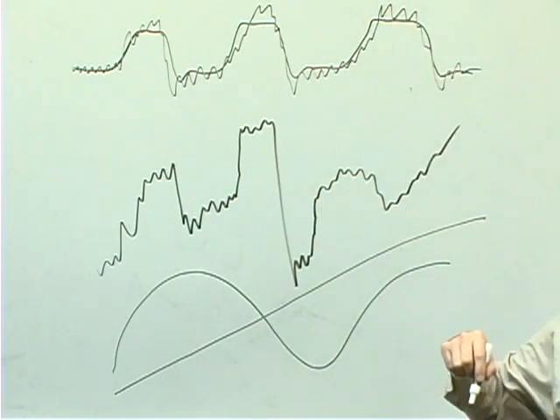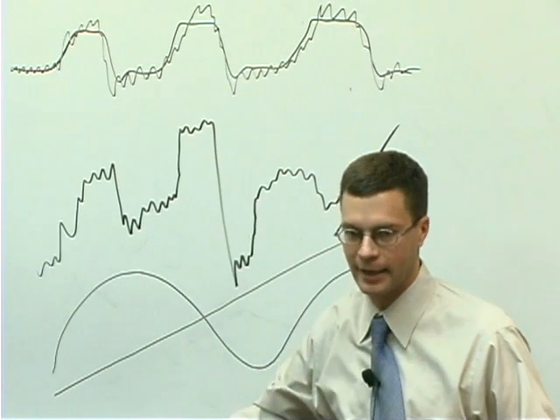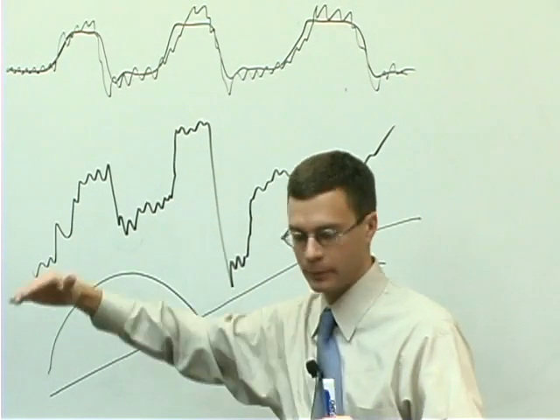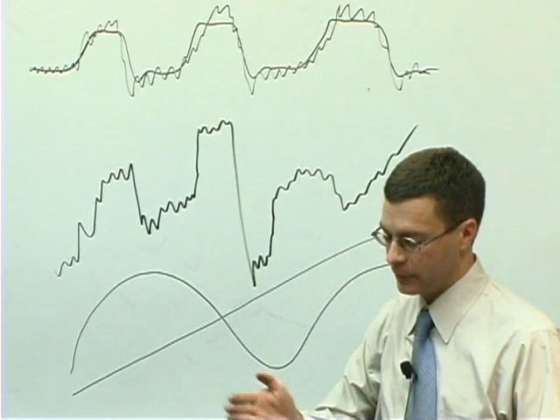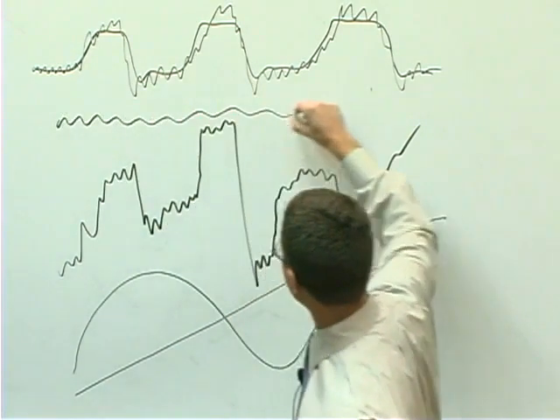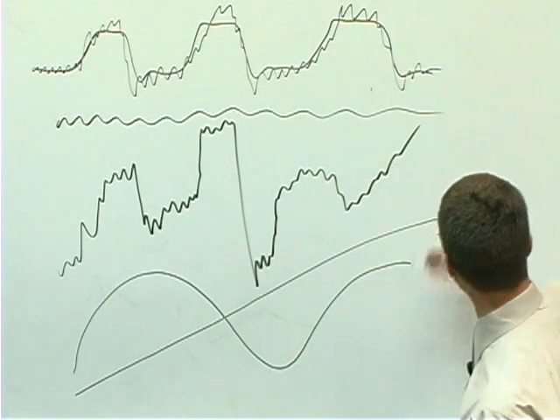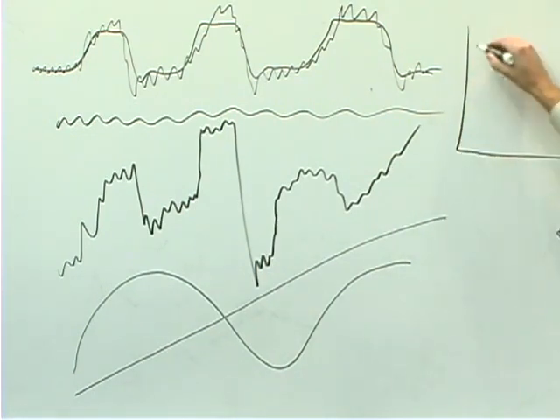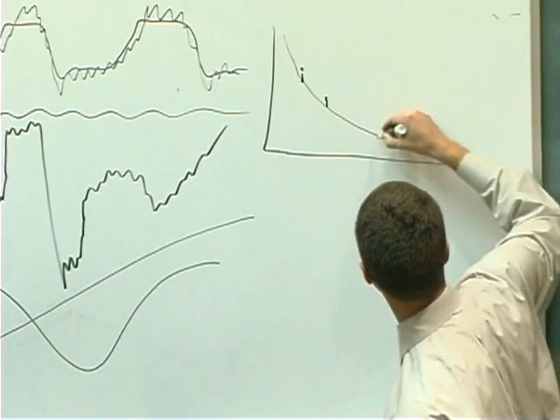Okay? So in effect, what you're doing is you're removing variance or variability in the data that's at this very low frequency range. Now, of course, you don't want to remove the frequency that is your experiment itself, because then you'd just be left with this. Okay, which would be a mistake. So generally, what we do, in terms of a power spectrum, if there's the noise power spectrum and here's your task effects, right?